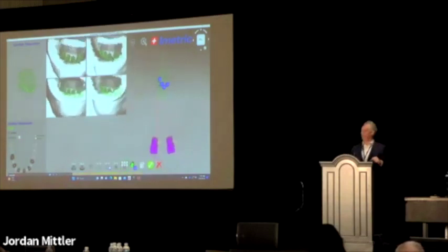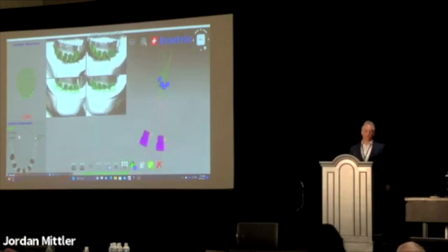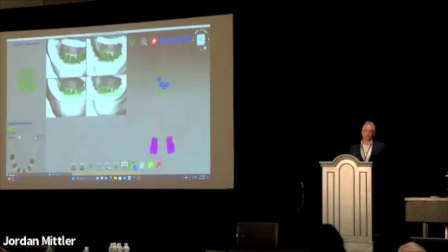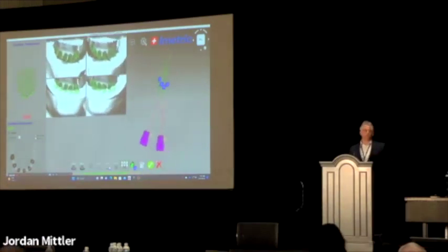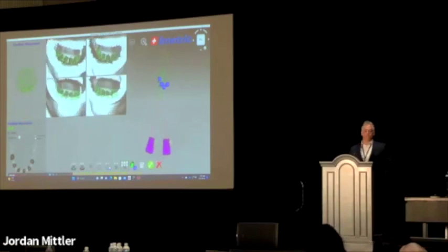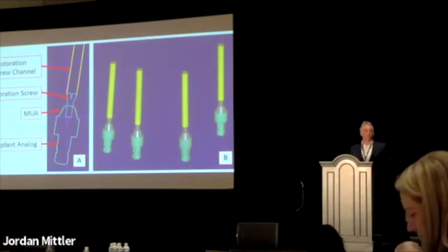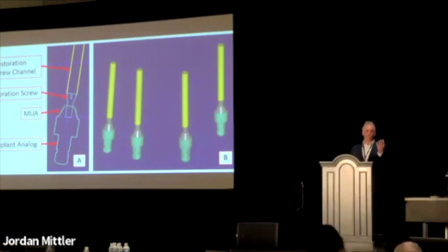And so the pink represents the camera, the blue represents the scan bodies, and you can see through the 4 cameras on the scanner that it's just taking pictures of those in different angles. And the software, just like the building and just like the apricot, is going to stitch those together. And what is the result of photogrammetry? The result is just implant position for now. And so I make this point. If you look here, what is important? Well, I now have an accurate rendering of the exact position of those implants in space and the relationships together.